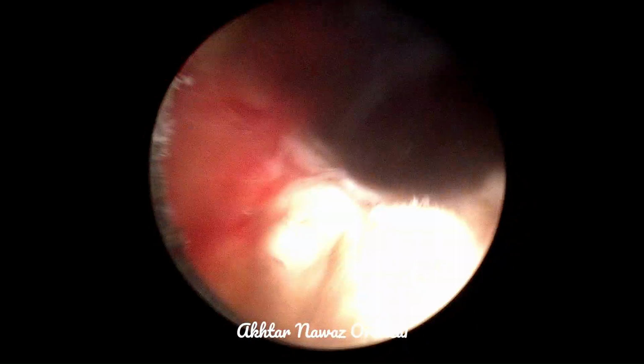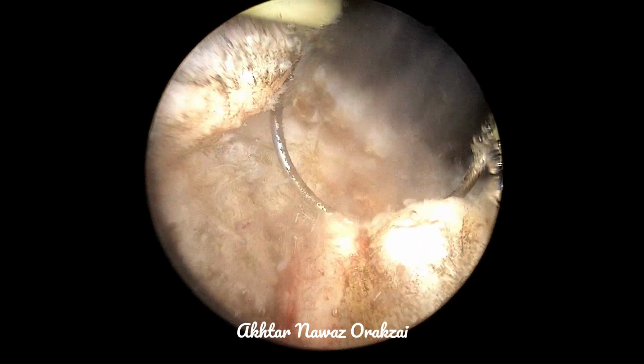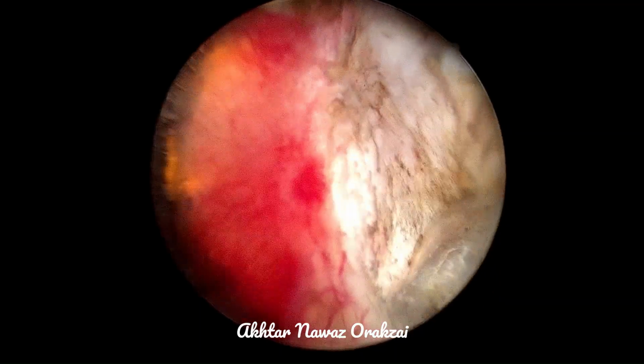So for a beginner that would be a little bit difficult. So we make a map and we just resect the area.